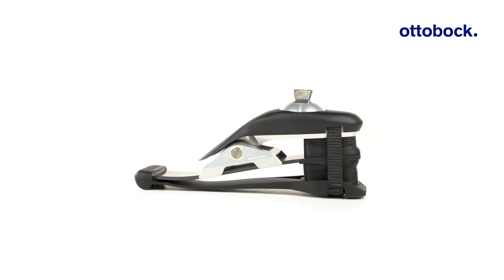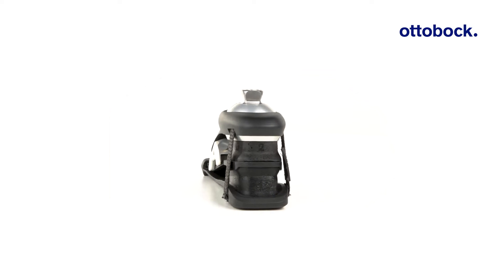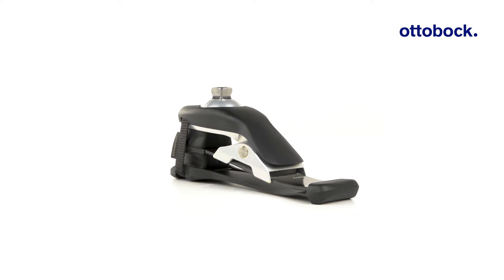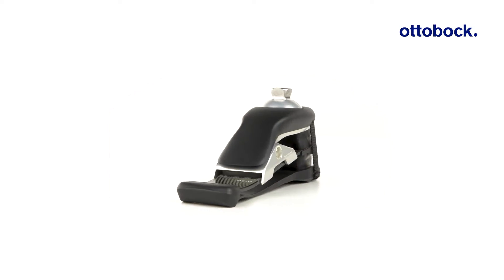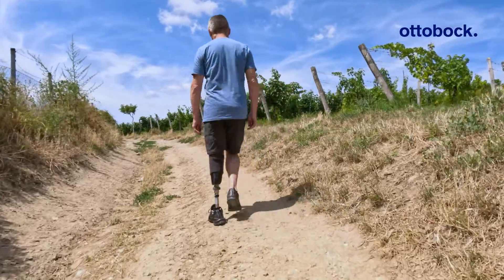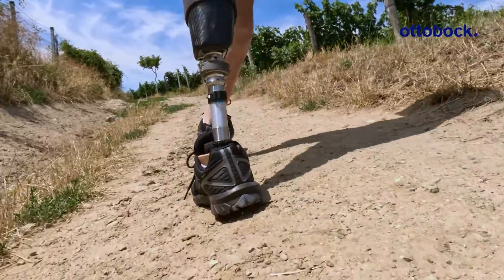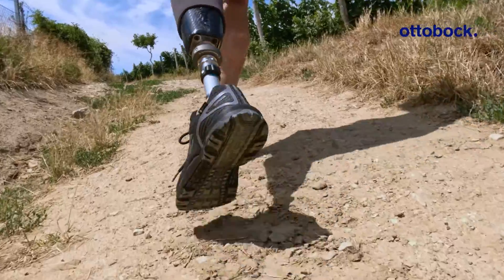Let's meet Evanto, a carbon fiber prosthetic foot that revolutionizes energy storage and return. This unique foot optimizes energy input and output by combining high rebound heel wedges, a new carbon spring design, and an innovative ankle joint. Evanto is the ideal all-day partner for indoor and outdoor use. Notice the multi-axial adaptation which makes walking on varied terrains very comfortable.